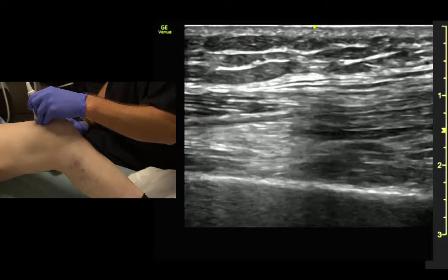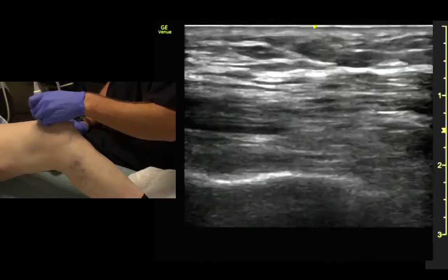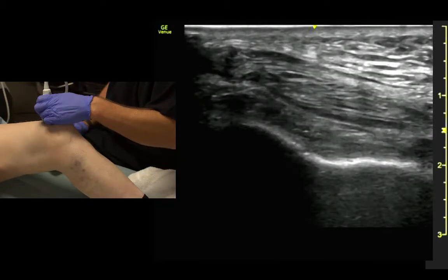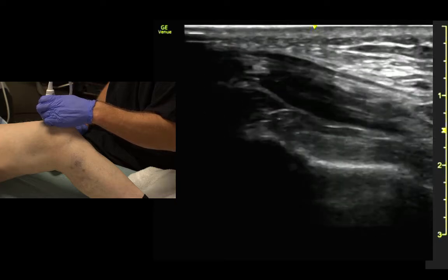We can follow it up. If we rotate with anisotropy, we can see what it looks like in short axis — it gets dark.